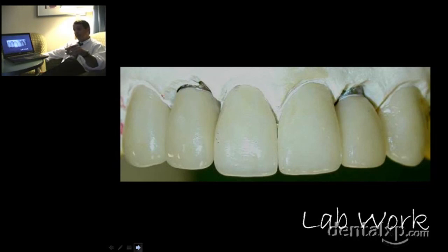It also is deep enough so that if we get any recession, you're not going to show the top of an implant. Because as people have said, you have one opportunity to get your implant in the right spot. And if you place that implant too close to the free gingival margin, and you get a little recession and you show the head of your implant, there's not much we can do to cover the soft tissue of the implant. And it becomes very difficult to save an aesthetic failure when the top of the implant is being shown. So if anything, I would err on placing the implants a little too deep instead of too shallow. And a shallow implant can't be corrected too easily.